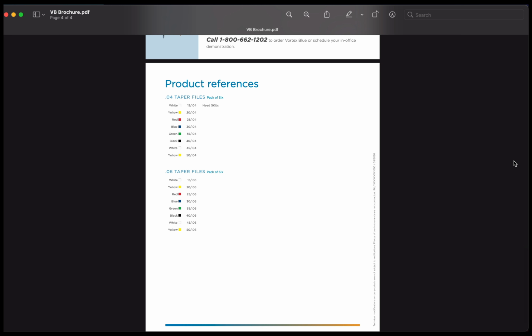They're a very flexible file. They can handle significant curvature, and you can control how narrow or how wide you want to prepare. Also, the smaller files in this system, the 15, the 20, and probably even the 25, have so much flexibility that you can very easily pre-bend the rotary files to get them into position. You can do that as well with the ProTaper Gold. It's just that because it's a chunkier file, you can't pre-bend it quite as much.